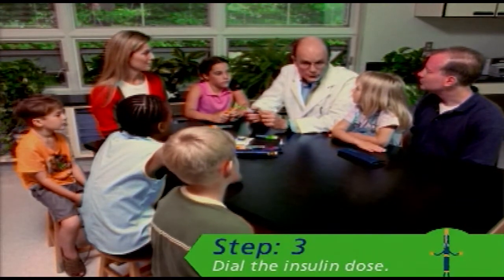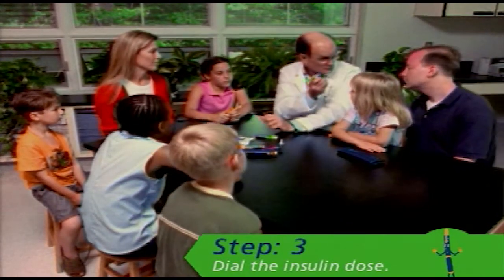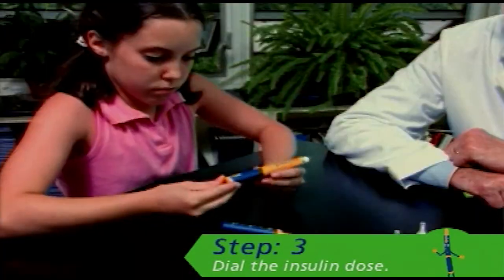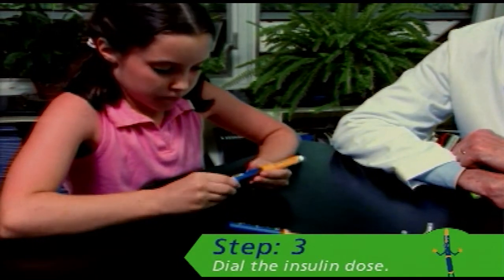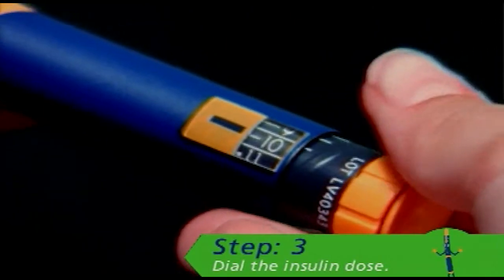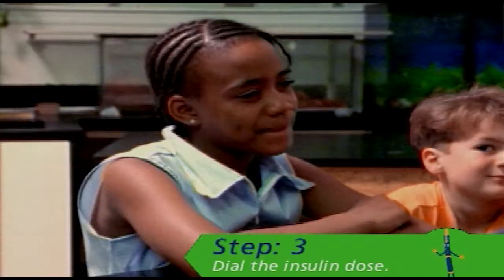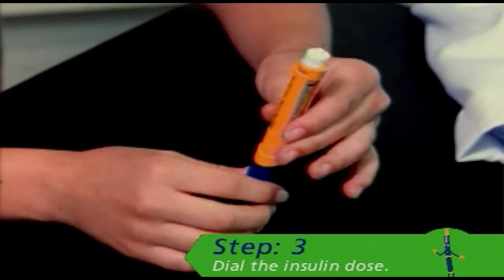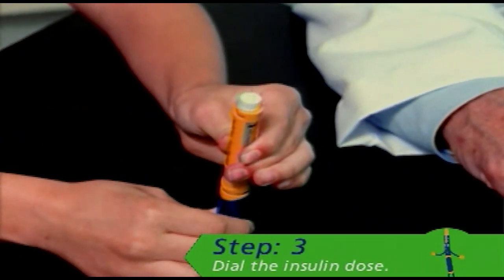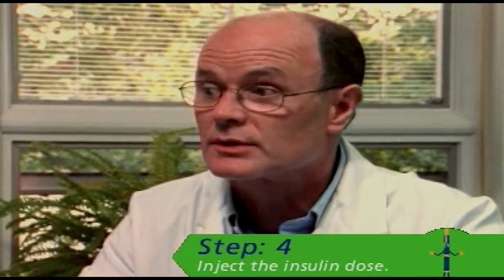You're now ready for step number three: dialing your dose. But first, make sure the dose indicator window is set to zero. Next, turn the dial-a-dose selector until your dose appears in the dose indicator window. Half units are shown as long lines between the numbers. If you dial too large a dose, no problem — you can cancel the dose without wasting insulin. Pull the cartridge holder down and away from the barrel, and while holding them apart, gently press the push button against a hard surface and release your grip. Now, the most important step: injecting the dose.